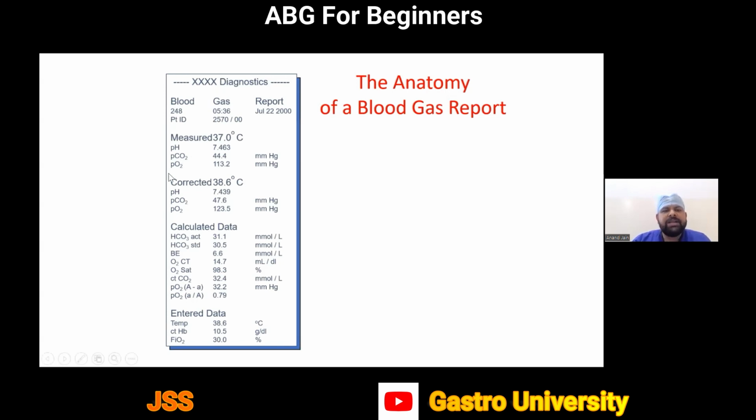And then come certain corrected values for a specific temperature. This temperature, which in this case is 38.6, is what we enter in the ABG machine at the time of its analysis. Whenever we are entering this data, we have to be particular that we enter the right values so that the corrected values can be extrapolated. But if we enter them wrong, will it make a difference? The answer is no, because we are actually concerned about the measured values.